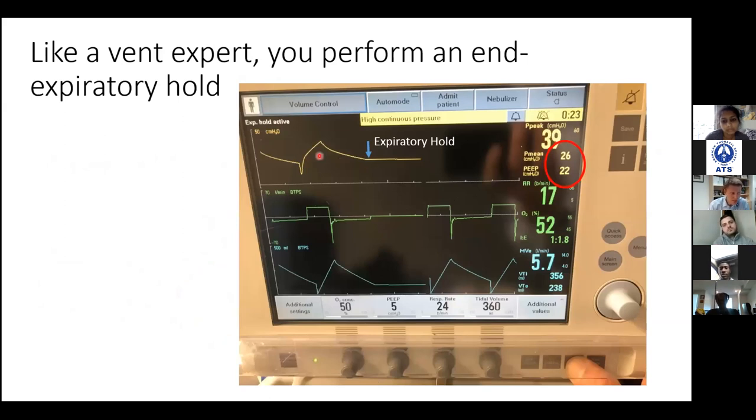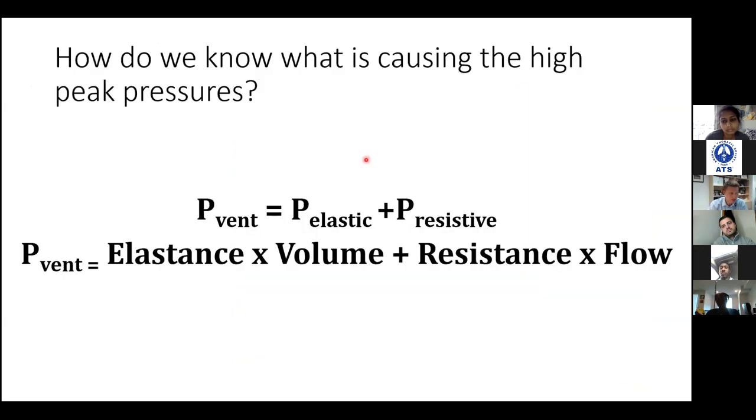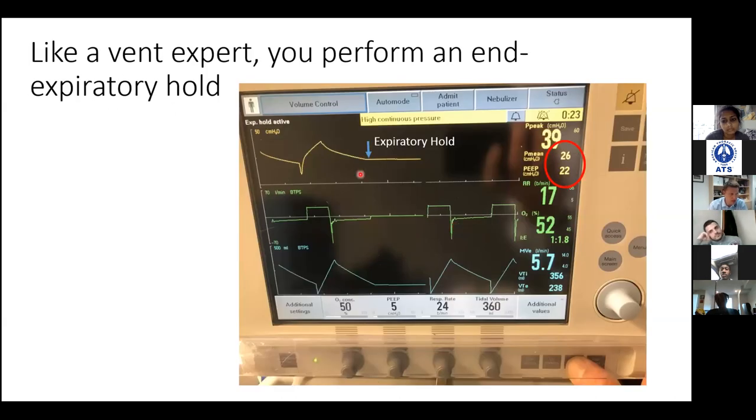That's exactly what we did here. So if you look at the end of expiration here, we hit this button down here called expiratory hold, and you see that the flow goes to zero. There's no flow in, no flow out. The only difference between this and an inspiratory hold is that this is at the end of expiration, inspiratory hold's at the end of inspiration, but it locks the circuits. And what you see here is then it measures the vent without any of the resistive components. All we're looking at is what the elastic component of the lungs is.